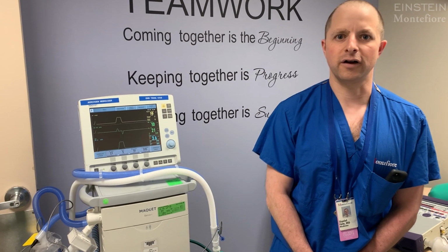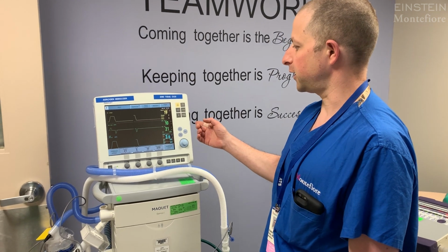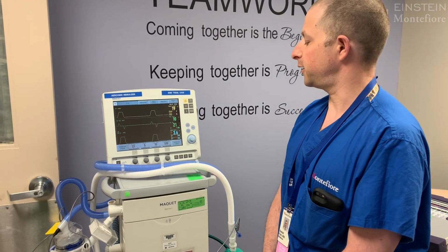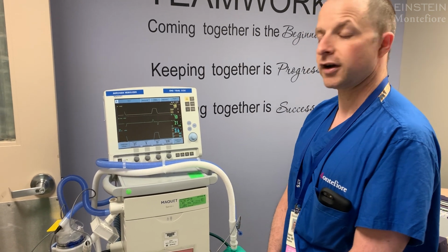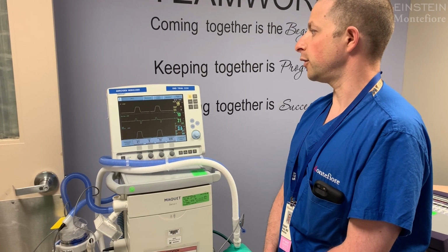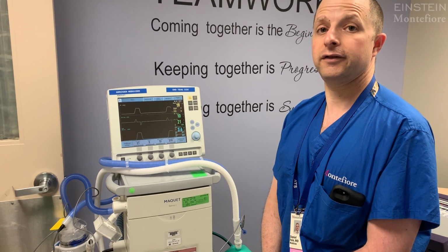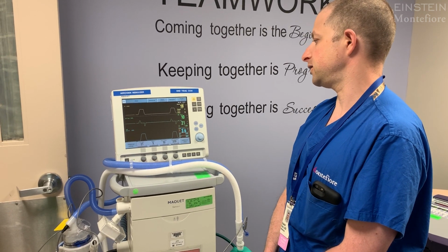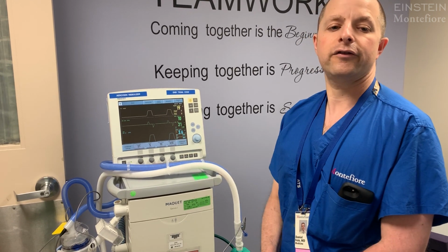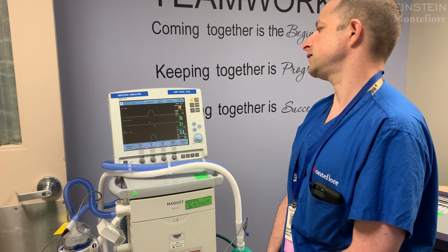Okay, so talking about the most common ventilators we see, this is the Maquet Servo ventilator. Prior to the COVID-19 pandemic, it was the most common type of ventilator that we were generally using both inside and outside of the ICU. The most common ventilator mode that we would use is called PRVC, or Pressure Regulated Volume Control. What happens in this mode is that we set a tidal volume and then we allow the ventilator to select flow based on the patient's compliance to meet that tidal volume.